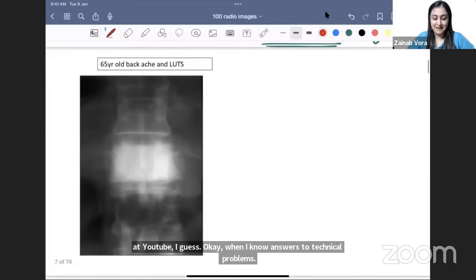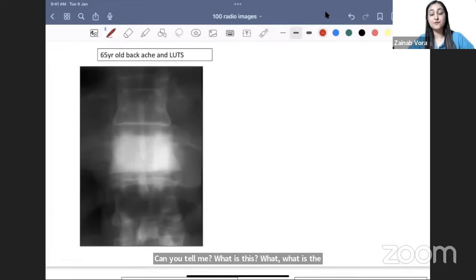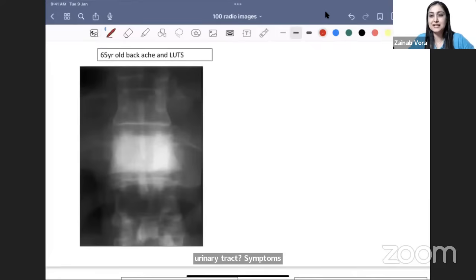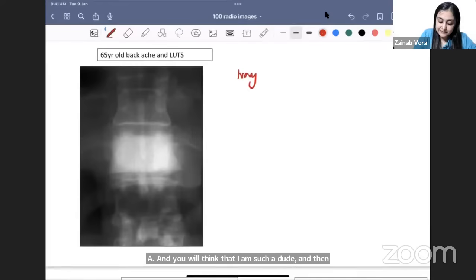A 65-year-old with backache and lower urinary tract symptoms — what is the diagnosis? I don't want you to say ivory vertebra because I've given a very specific scenario. Why would a Paget's patient have lower urinary tract symptoms? That's where the answer goes wrong — 90% of students will mark Paget's and get it wrong. This is indeed ivory vertebra, which has many differentials; top of the list is Paget's blastic phase, but it can also be blastic metastasis.